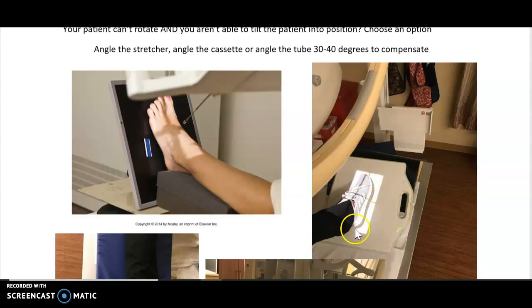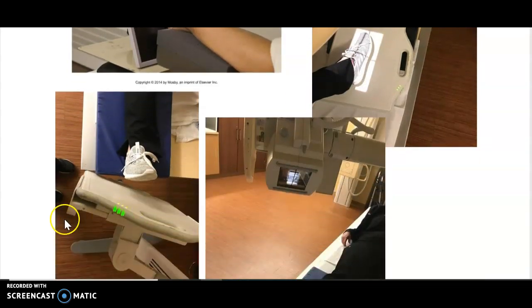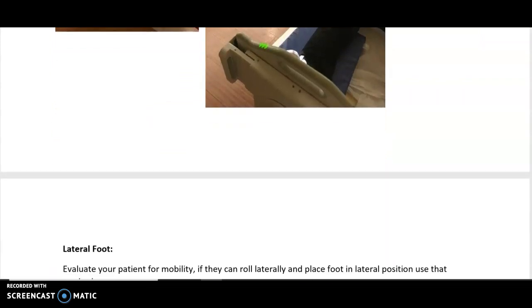Here's an example: if the patient can angle their foot into an oblique, you leave them in that position and match your tube angle to their foot. If the patient couldn't move, you use the tube angle to simulate the oblique. Anytime you use your tube angle, angle the way you want the part to move — for a medial oblique, angle that way. You can also keep the foot straight and angle the cassette instead, though that option isn't used as often. The beam shooting the foot medially will distort the part somewhat, but on these patients you're just trying to get the best images you can and give the radiologist what you're able to get.